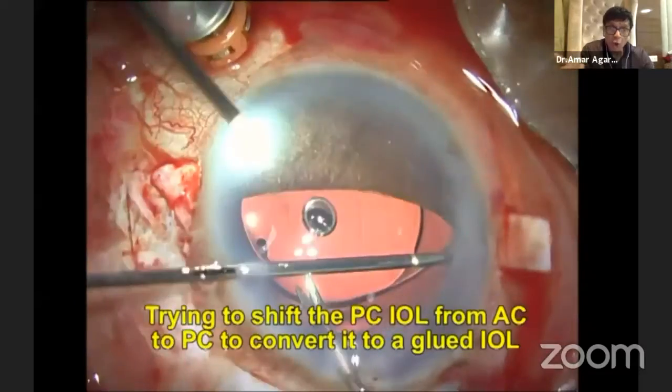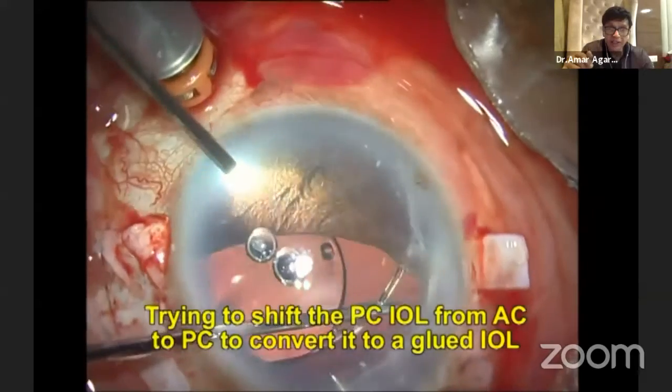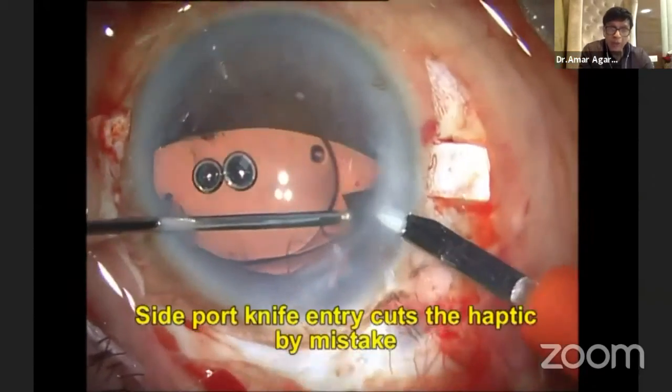Remember, it's a one-piece, non-foldable IOL which has been implanted in the AC. I'm trying to do that, but look, it's not happening.